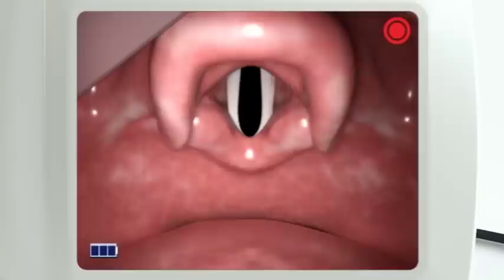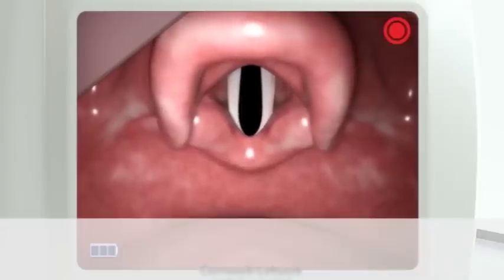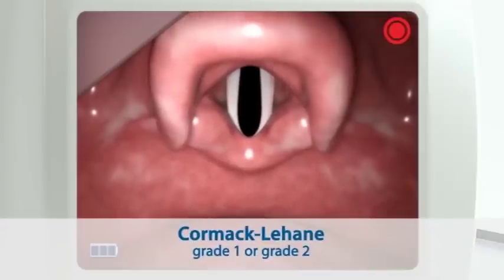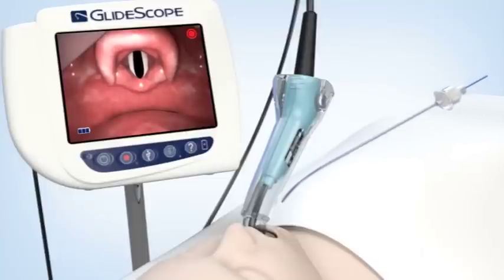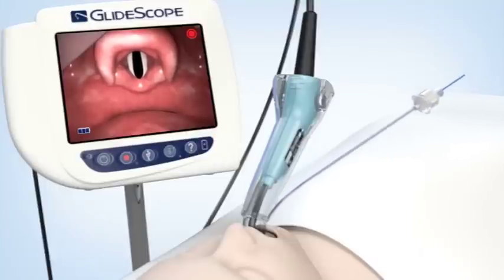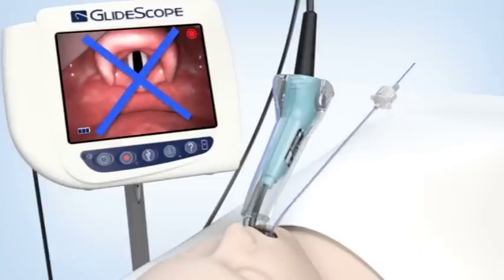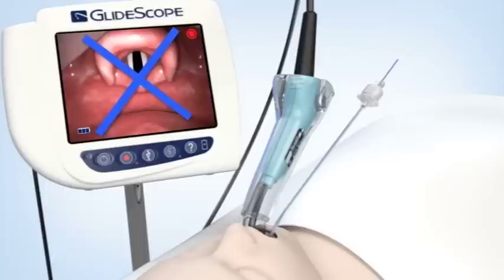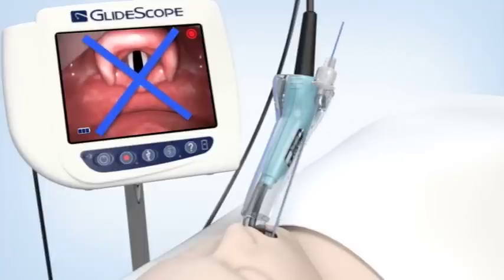The video image of the glottis using the GlideScope Video Laryngoscope typically is a Cormack-Lehane Grade 1 or Grade 2 view. At this point, the user may be tempted to immediately insert the endotracheal tube and try to navigate it through the glottic aperture while continuously looking at the video screen.